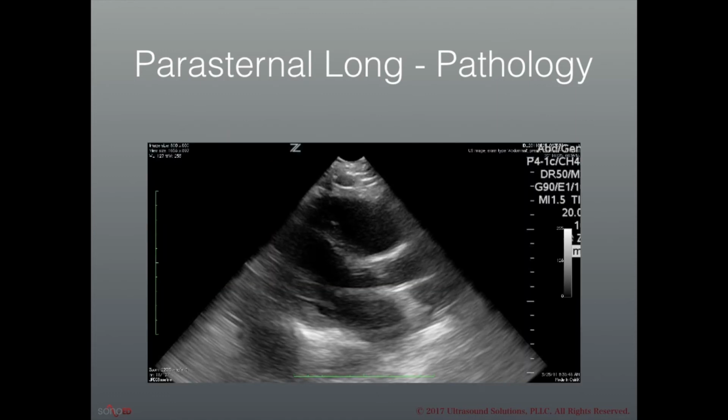And here's an example of the heart in cardiac standstill. Now, occasionally you'll still see this agonal movement of the mitral valve, but I would feel comfortable calling this cardiac standstill. There's no reasonably functional organized cardiac activity.